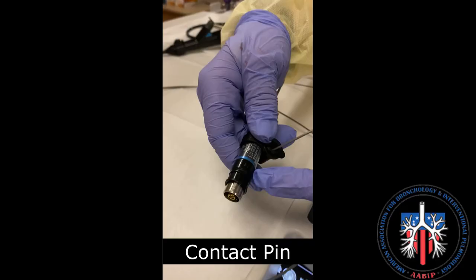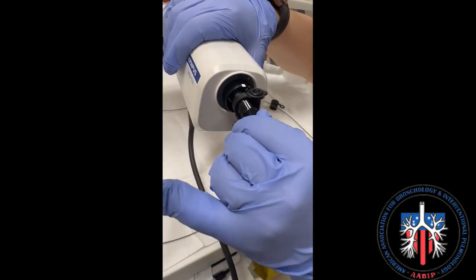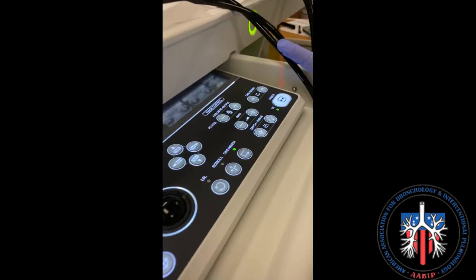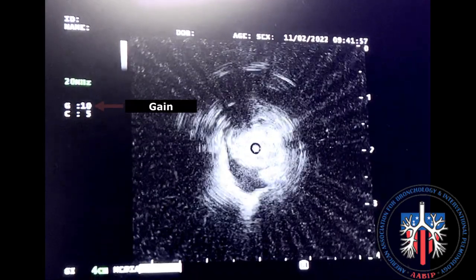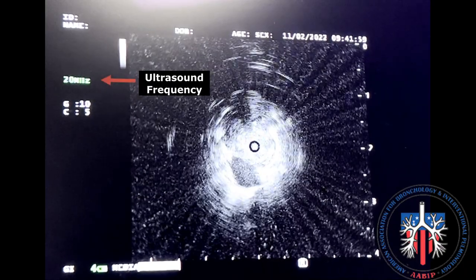To connect the probe to the driver unit, identify the contact pin and insert the pin in the orientation as shown. The probe is hung as shown next to the driver unit. Press the freeze button to activate the ultrasound. Features that can be seen on the ultrasound screen are the depth of view, gain, contrast, ultrasonic frequency, and the center of the probe.